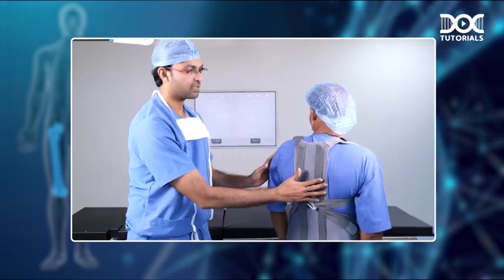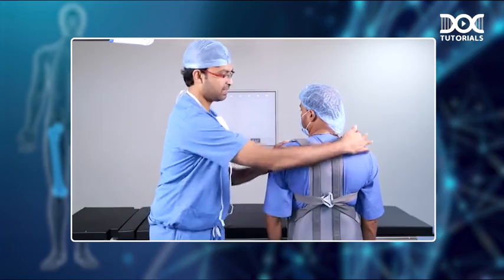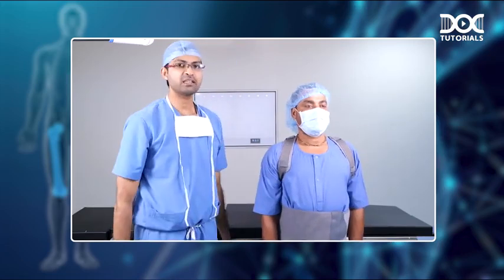So you can see this is how you apply the Taylor's brace. This is from the back and this is from the front. This is your Taylor's brace.